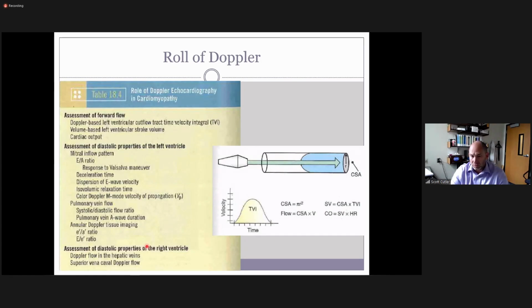In that case, too, you can also get rounding of the aortic tips at the end of that M-mode. That would be an example of a severe bleed or something like an internal hemorrhage. But in this case, it's a big dilated chamber. We already know that the ejection fraction probably isn't super great, so it would not be surprising at all to see a lower than normal VTI and peak velocity on the LVOT. All right. So those measurements will do that.